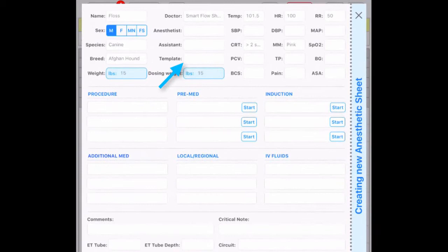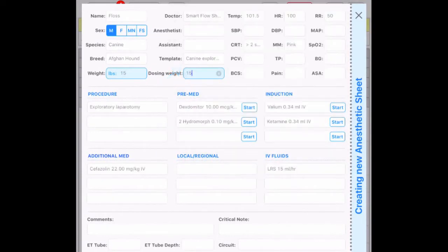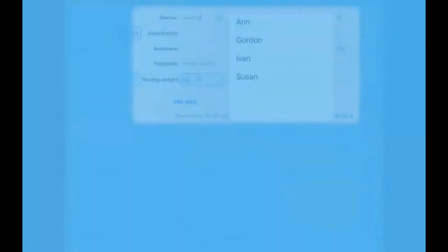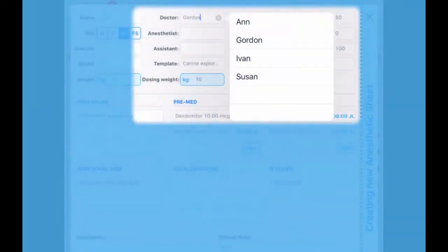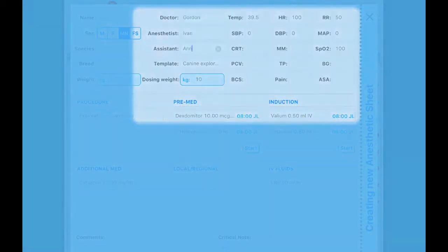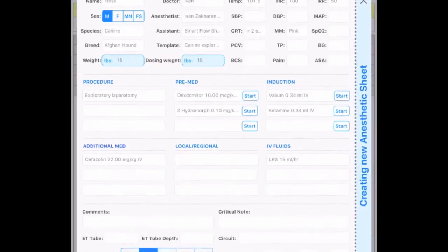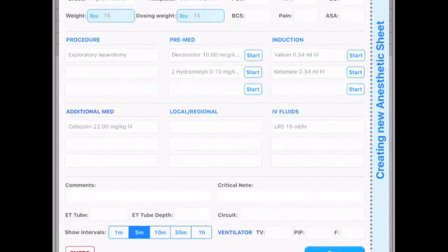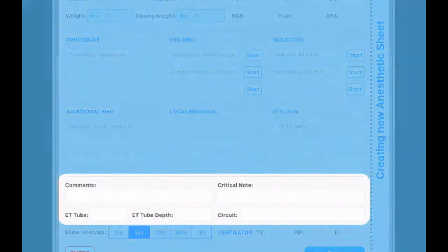Here you can choose your template that will populate your pre-medications, induction agents, fluids, etc. On this page you can also enter the doctor, anesthetist, and assistant along with other pre-op vitals. There's also room for comments and critical notes.